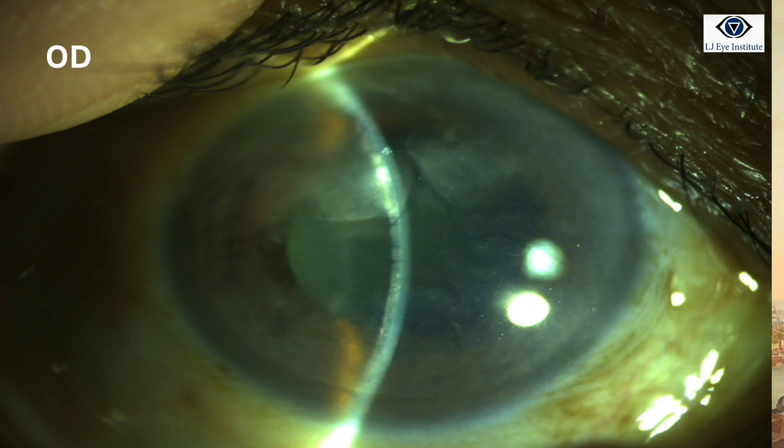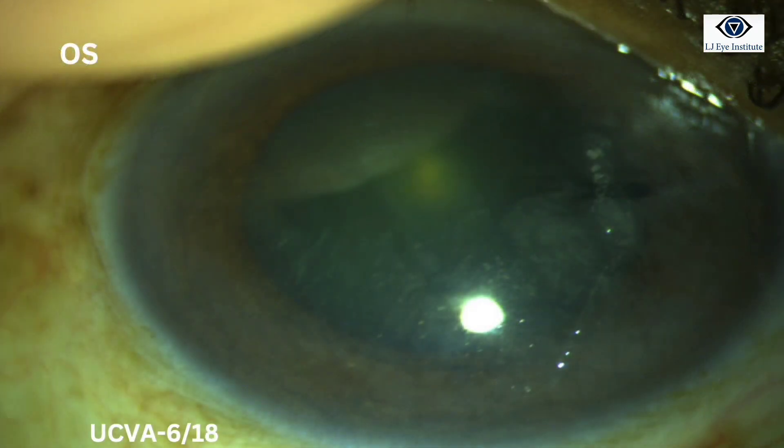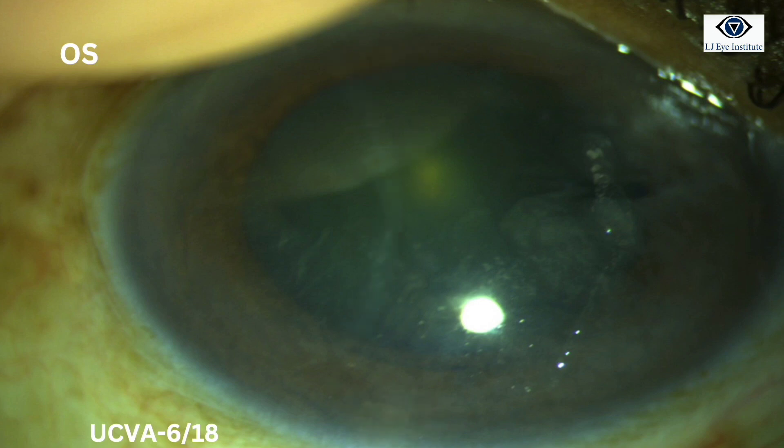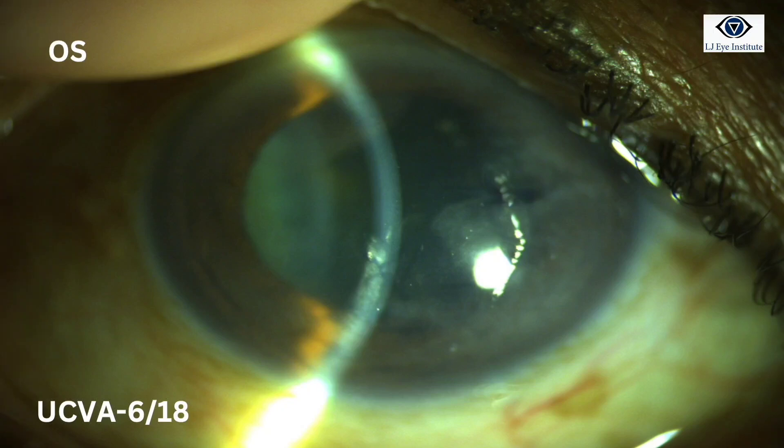On slit-lamp examination, there were multiple diffuse corneal opacities, more like dense lesions which appeared to be at the level of endothelium. On examining the other eye, we could note exact similar findings.